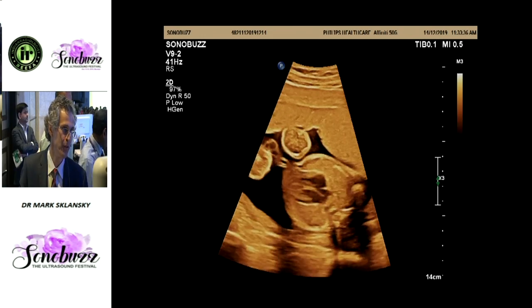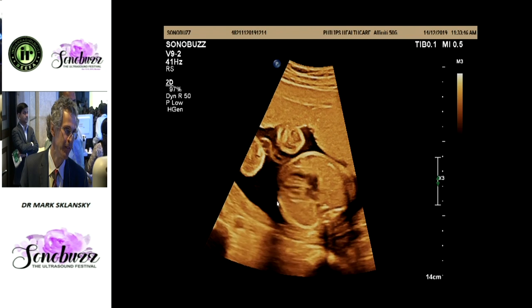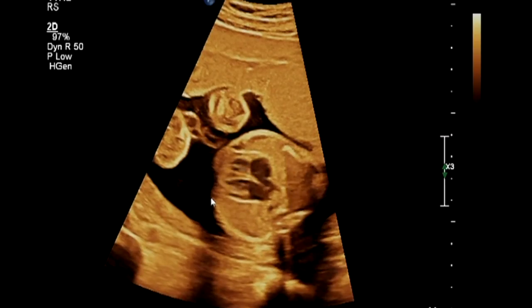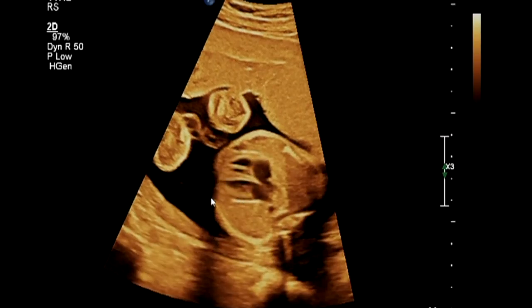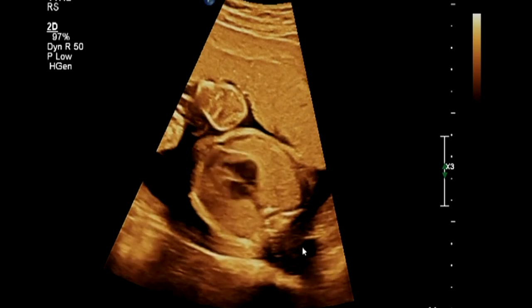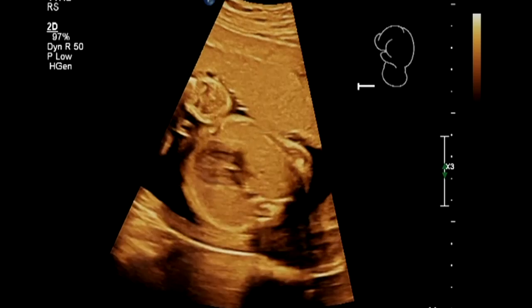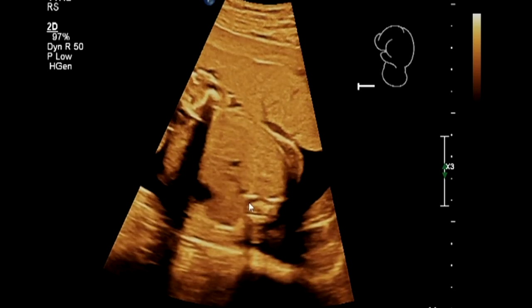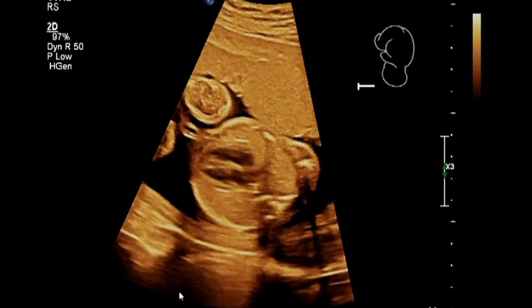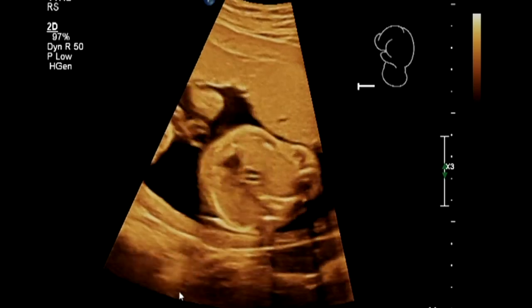Here's the stomach on the left and the heart on the left. The axis is normal, about 45 degrees — not left axis deviation and not mesocardia. The cardiac axis looks perfect and the heart size qualitatively looks normal. You can see the descending aorta to the left of the spine and the inferior vena cava rightward and anterior. That's visceral situs — visceral atrial situs solitus, or normal.